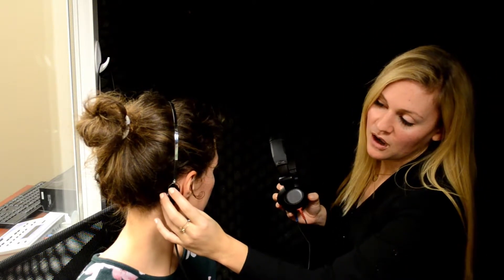Now we're going to show you how to do masking for bone conduction. It's a little bit more tricky when you have headphones, so that's why we're going to use headphones instead of inserts for this. We have the mastoid bone conductor on the right side, so that means we need to mask for the left ear.